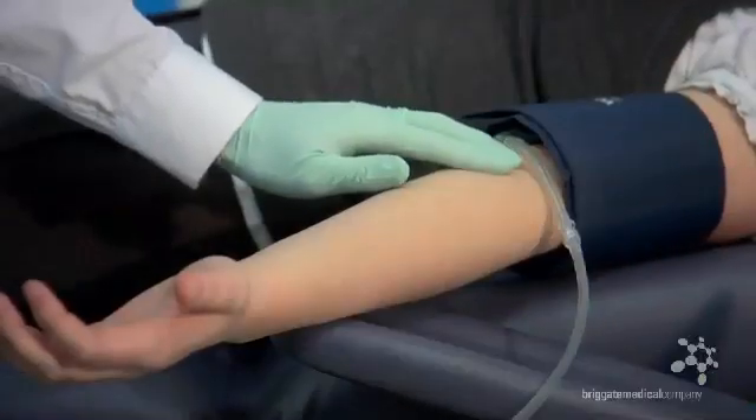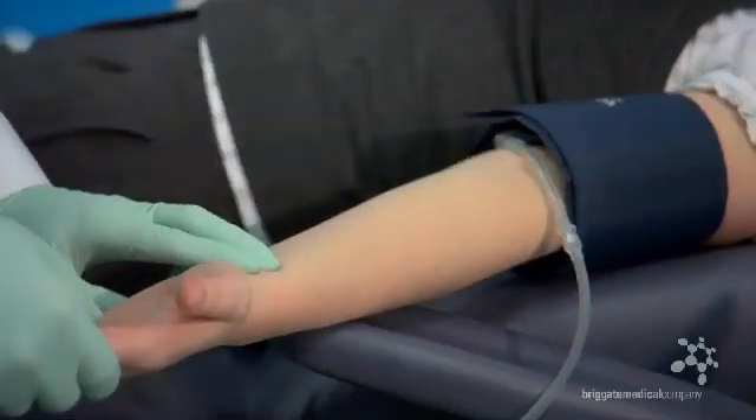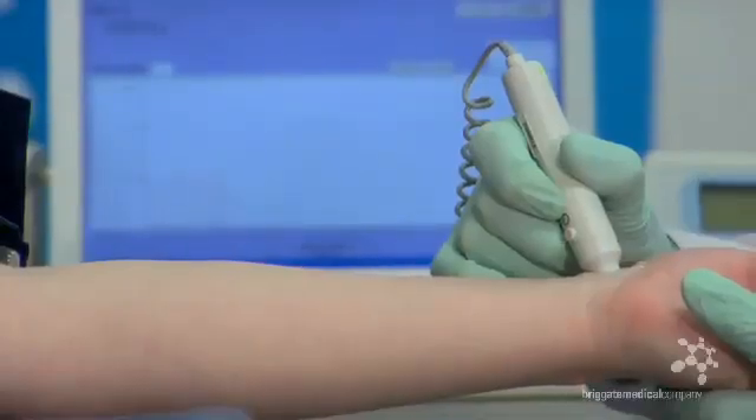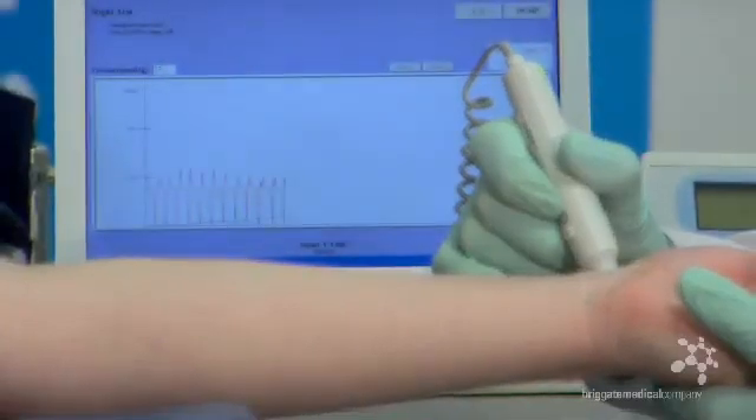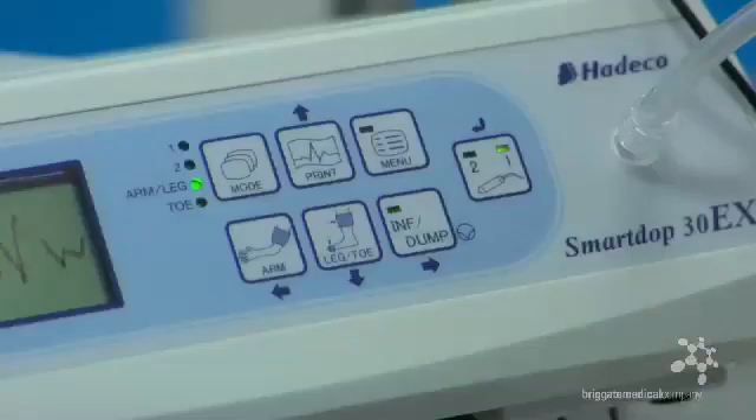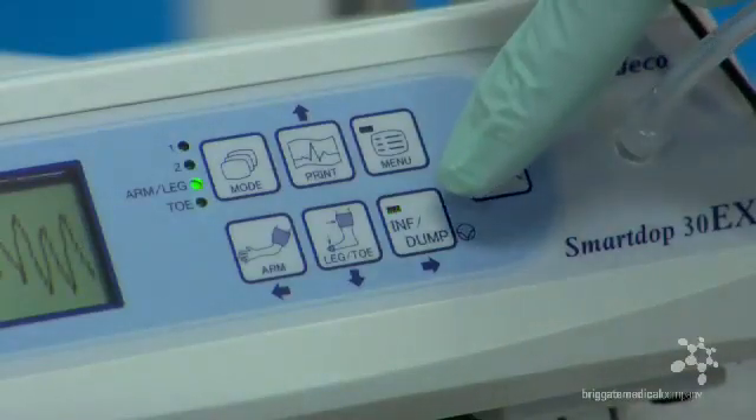Couple up the air tube and locate a pulse at either the brachial artery or the radial artery. Using the 8 MHz probe, locate a nice, clear and crisp blood flow. The SmartDop30EX will acknowledge the clarity of this reading by flashing the inflate button on the face of the Doppler and the inflate icon on your computer screen.